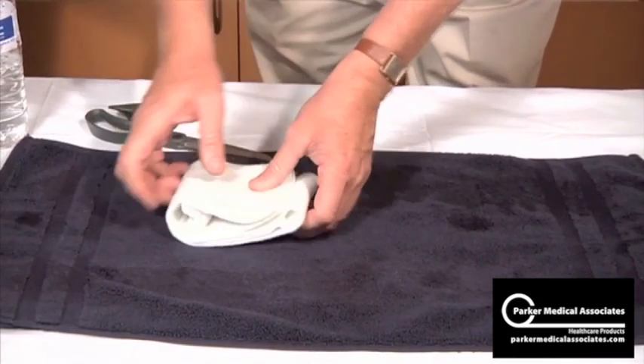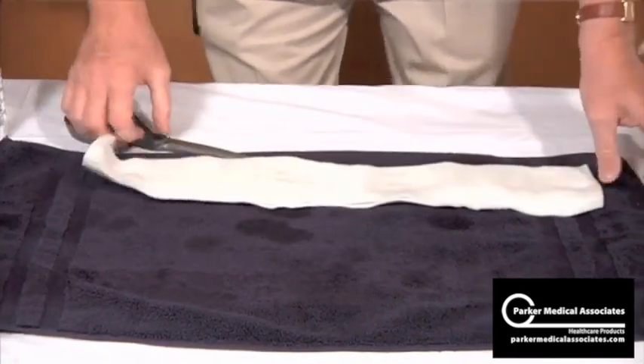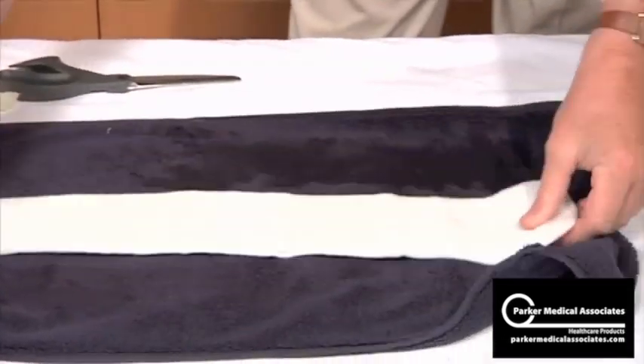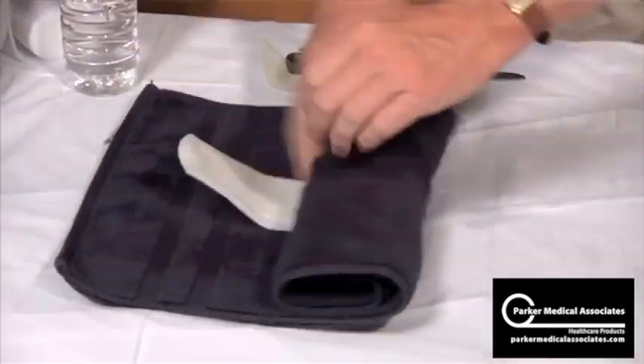And then just fold, fold, squeeze. Place it on your towel and just roll it up once. Squeeze the dry side. Roll and squeeze a second time.